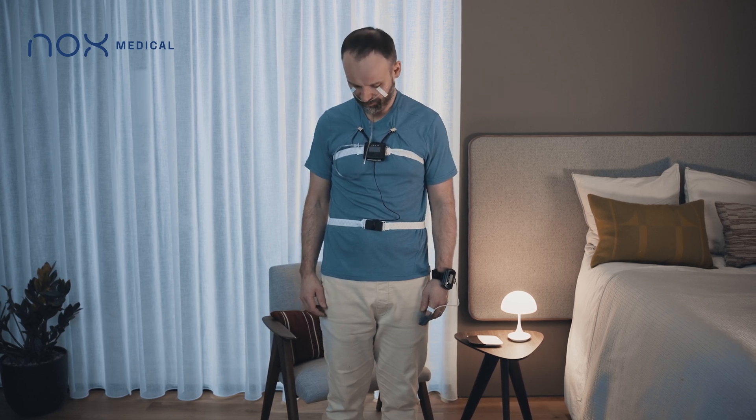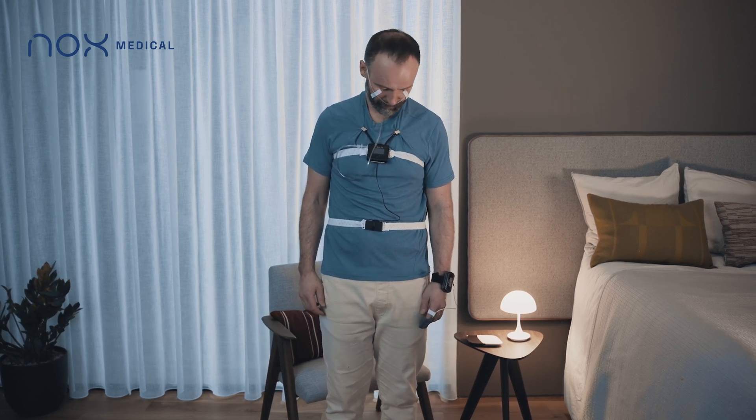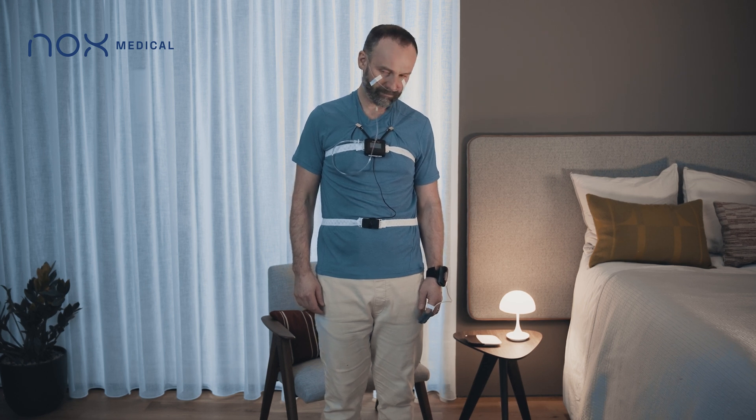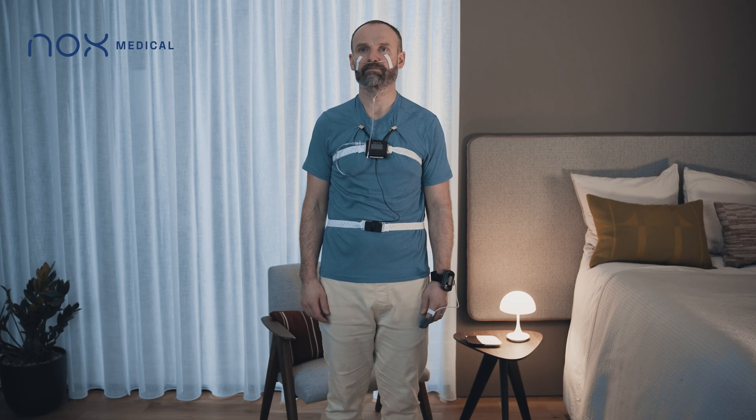You have successfully finished attaching the Knox T3 sleep system. Go to bed as you would usually do. Once you have completed the test, do not discard any of the sensors or items. Simply place everything back into the carry case and return.